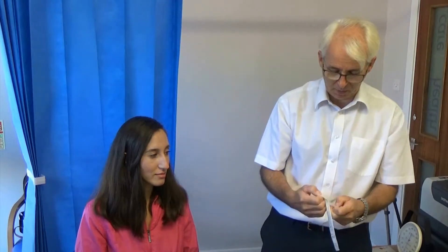So we open the swab and take it. As you can see, there's a little notch on the swab here which is designed for when you break off the swab, which you'll see later.